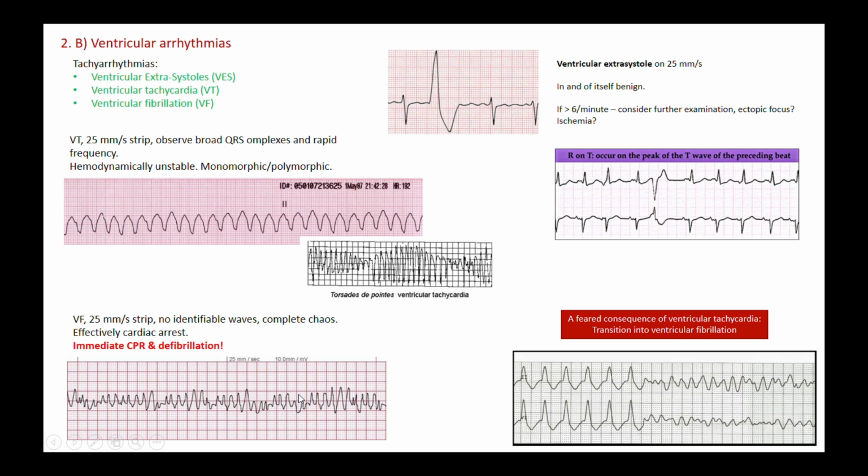just a flat line. And when you have a flat line, defibrillation is in and of itself not indicated, because what you do when you defibrillate, you give an electrical shock which knocks out all the myocardiocytes giving off this chaos, and you allow the sinus node to overtake and restart this nice normal pacing of the heart.